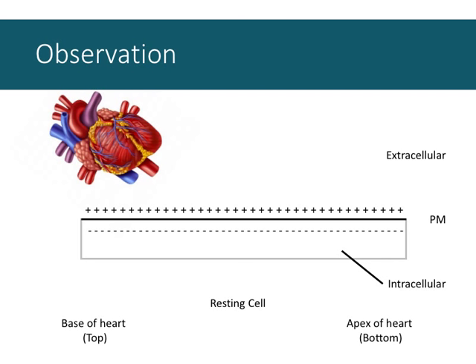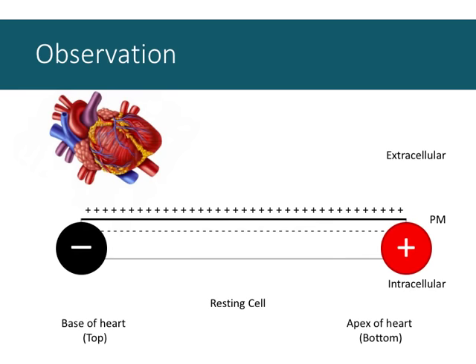And this is a bit convoluted. It's backwards from what we know about the lung. The base of the lung is at the bottom, apex is at the top. Here the apex of the heart is the point in the ventricles. But roughly, these are parallel. This cell, this long, skinny cell, is lined up in line with the electrical vector of the heart. And if we were to measure or monitor electrical activity, we would simply place electrodes at either end of that vector.